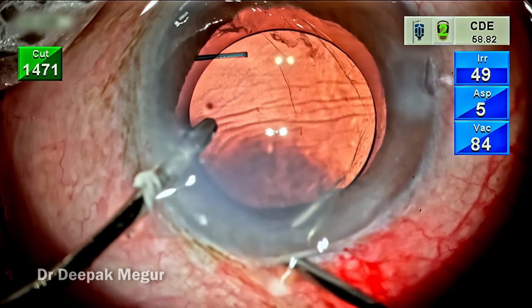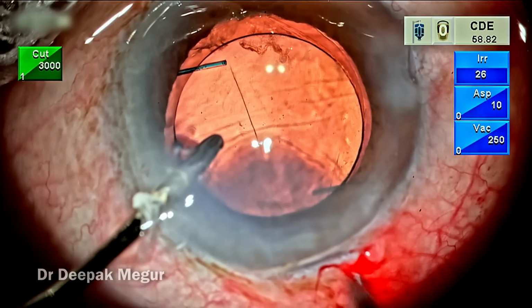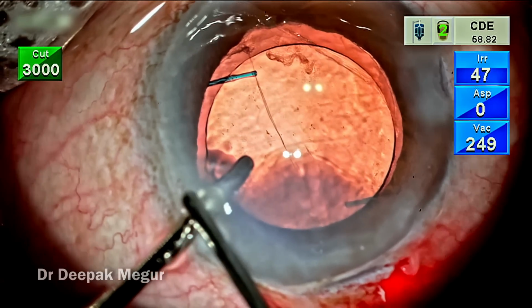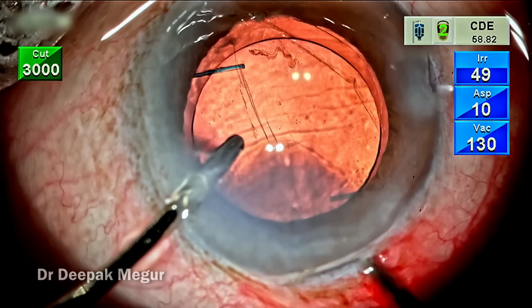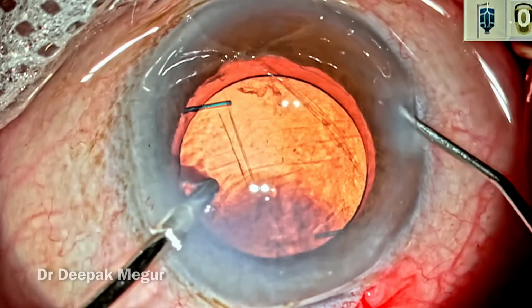When we're doing anterior vitrectomy, it's important to check near the incisions. You always find one fiber of vitreous trying to sneak out through these incisions. They've got a great propensity to sneak through the incisions. Always look for them, and eventually all the prolapsed vitreous from all the three ports is taken care of.